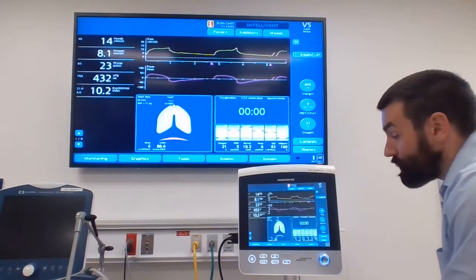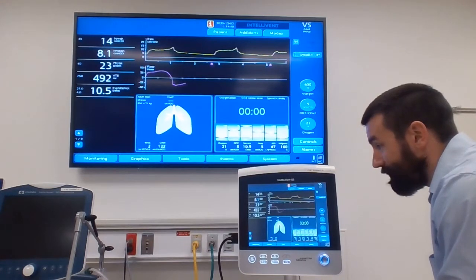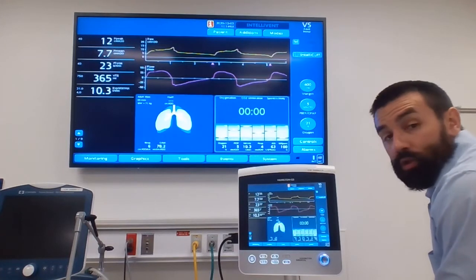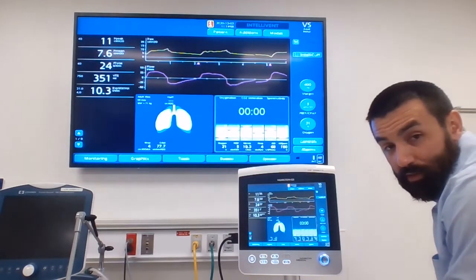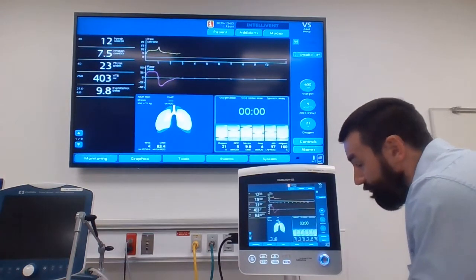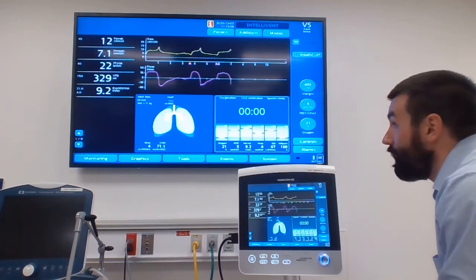So if you saw that they have a really low airway pressure, in this case it's delivering 5 centimeters of inspiratory pressure to achieve this 400 mL tidal volume, you could actually extubate a patient from this if you wanted to. Or if you're a little bit scared, you could switch them over and do a formal spontaneous breathing trial just to see how they're doing. But you can see everything is falling into what it considers acceptable parameters, and my timer is started here.